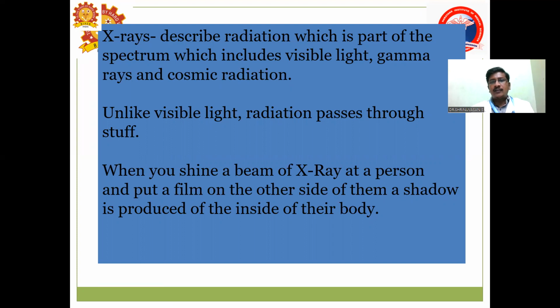Unlike visible light, which we can see directly with our eyes, X-rays cannot be visualized directly. But they can pass through our body and produce an image on a specialized plate called the imaging plate, the X-ray plate, and that can be seen as an X-ray, and we can interpret what types of pathologies we have.